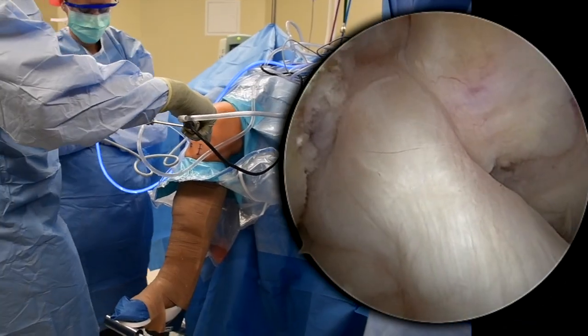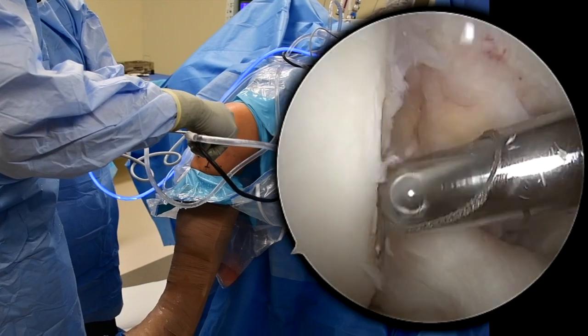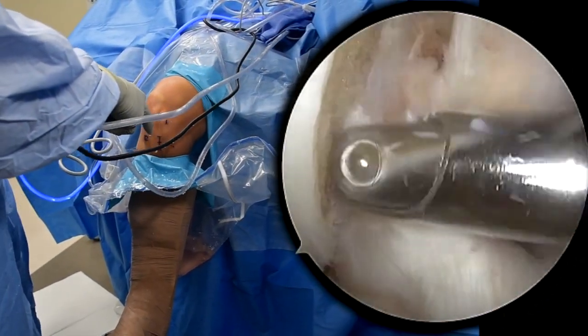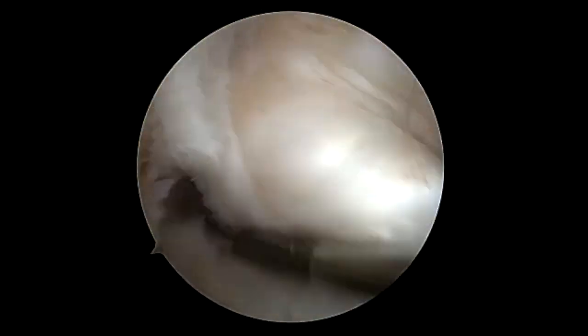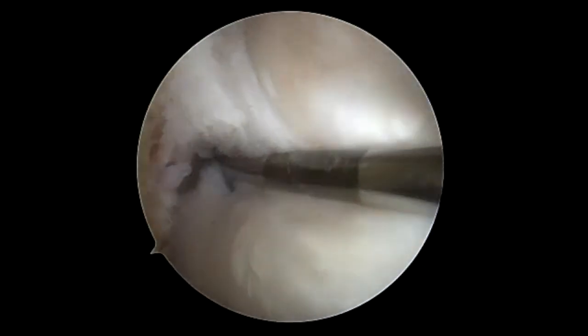We begin by viewing the ACL from the anterolateral portal on the right side of the knee. Notchplasty was then performed using a bone cutter. Ligament integrity was sufficient. However, the femoral attachment, particularly on the anteromedial band, was found to be insufficient and avulsed from the femoral side.